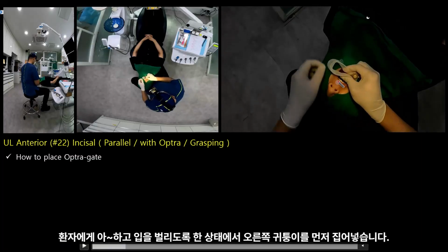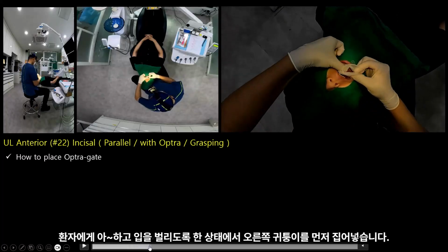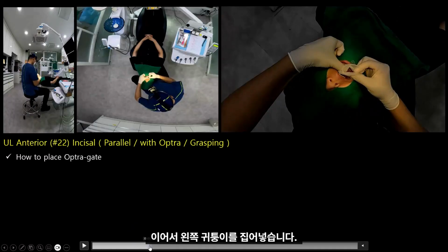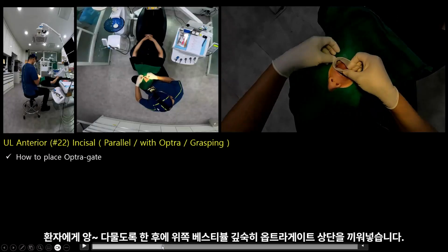With the patient's mouth wide open, instruct them to say "ah." Then begin by inserting the right corner into the corner of the patient's mouth. Next, the left corner is inserted into position. Then ask the patient to bite down firmly.